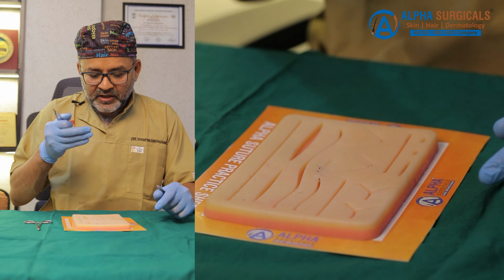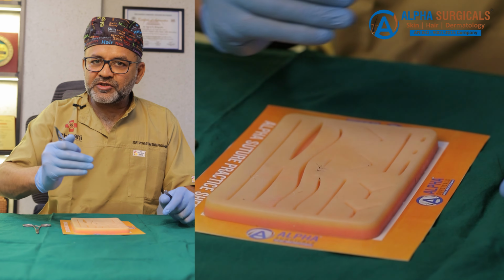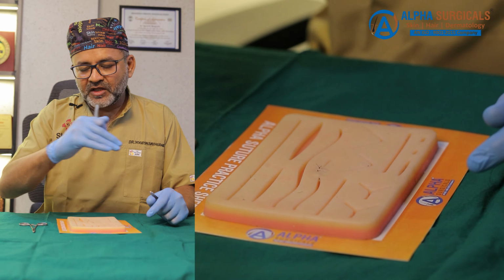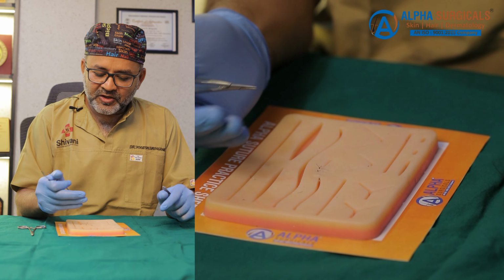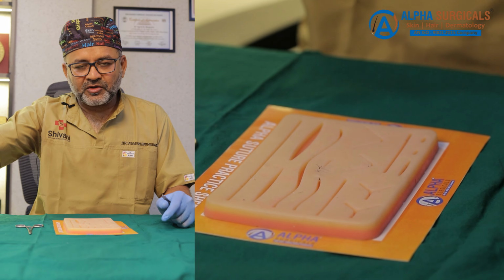So we have to give consecutive 1, 2, 3, 4 in a sequence to give the closure of the wound, so that on the surface as well as inside the wound there is no space left. And after completion of these intradermal stitches, we are going to do the vertical mattress stitches on the surface.